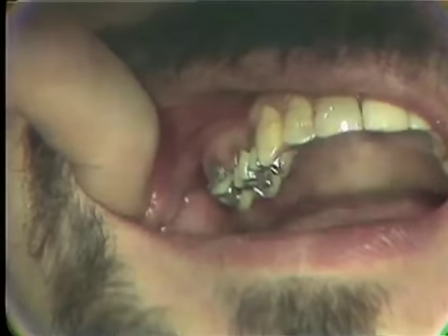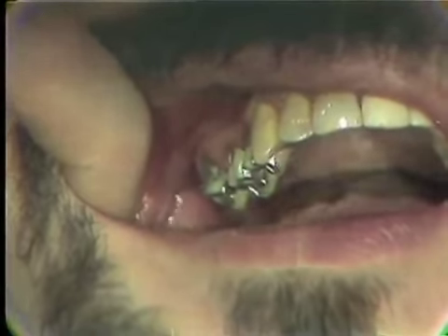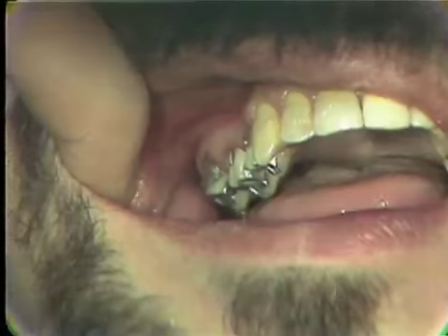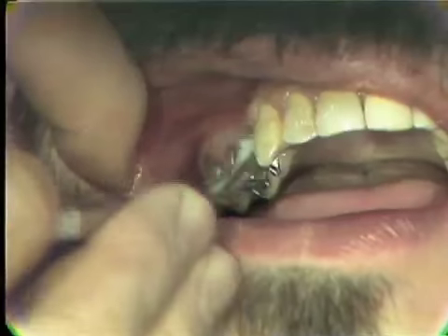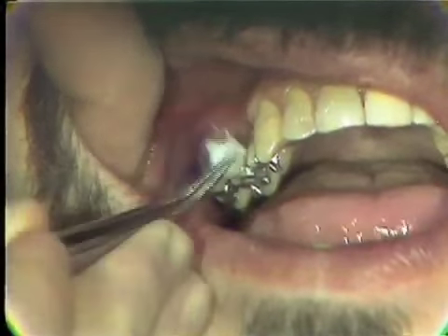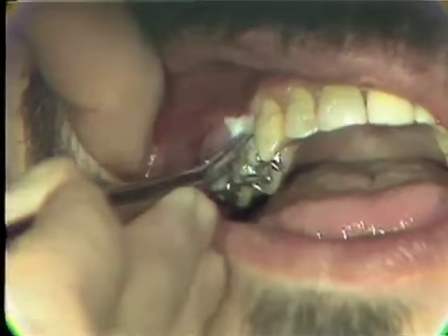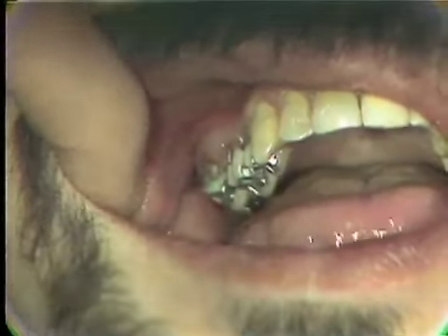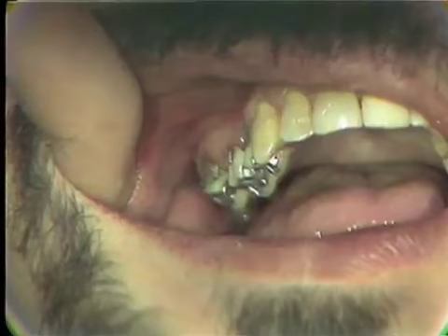We would want to lubricate this well with lubricant, and then we'll paint Duralay on the tooth and put the temporary to place.